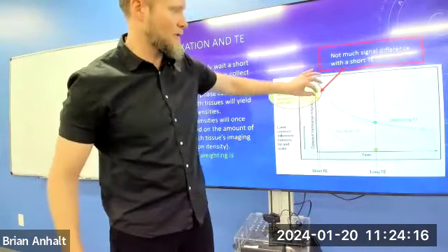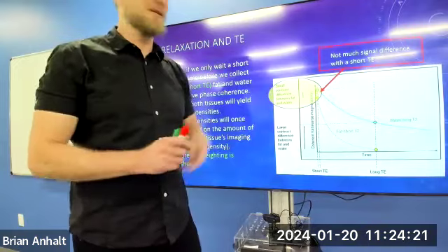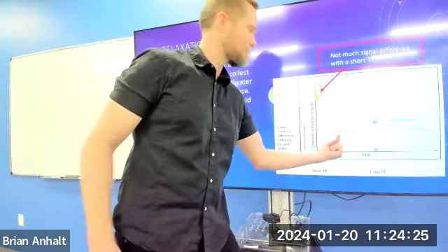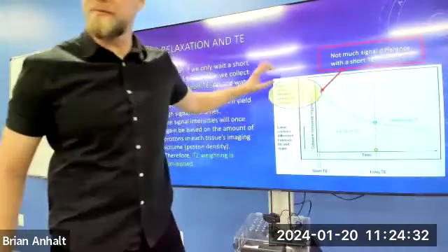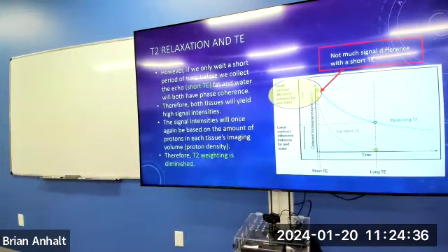So we're just simplifying the explanation by not showing the 180 degree. You just have to imagine it happened at 1/2 of this time. Okay. But the signal doesn't decay like this either. It would decay like that if there were no inhomogeneities and susceptibilities. But just simplifying the idea.